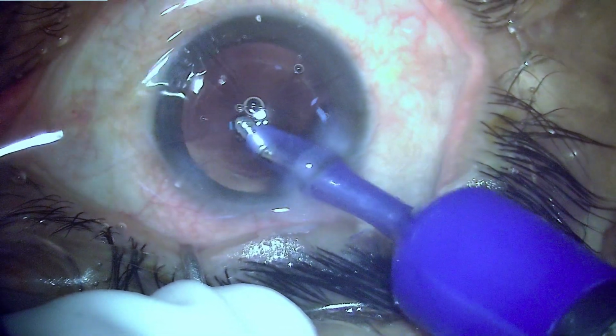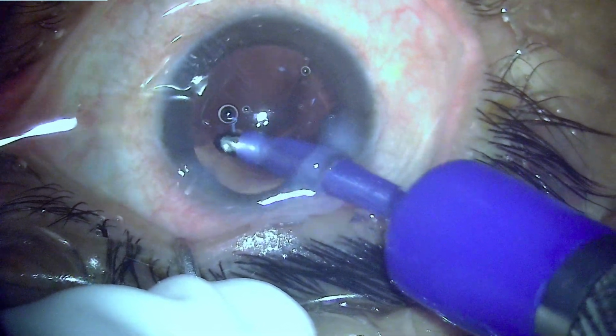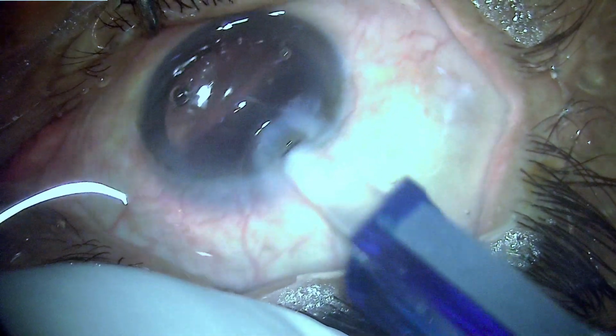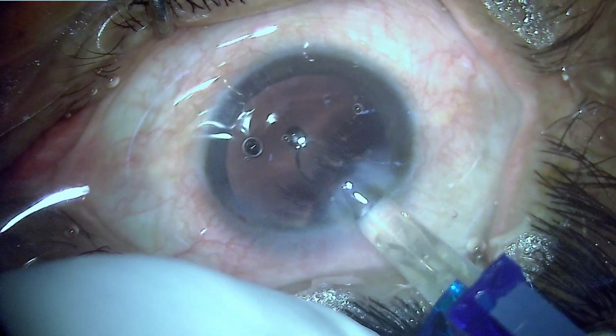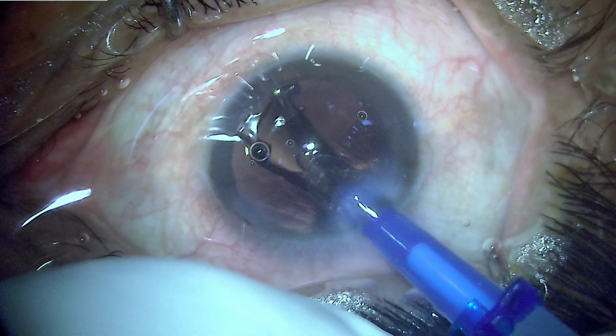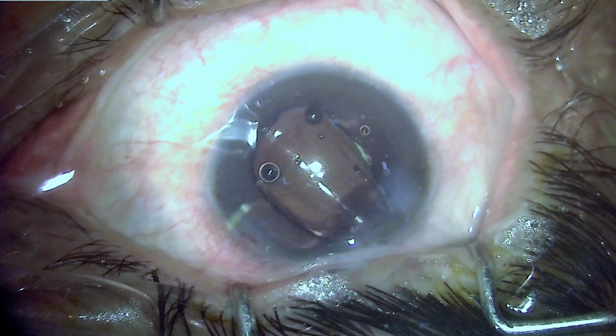Here the epinucleus and the cortex have been removed, and now we are left with a capsular bag into which we will implant our intraocular lens. This is a bifocal lens, and the IOL goes into the bag, the leading and trailing both the haptics.